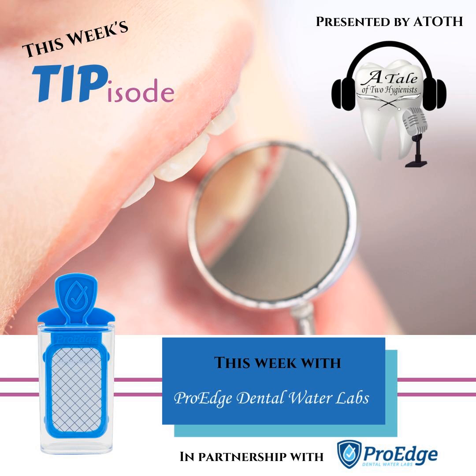It's more economical. And when you buy it, it's occasionally on sale. You can get it down to around $10. Let's say it's $10 per test. You put 4 samples from 4 devices in Op1, for example, so you do a pooled sample. That's $2.50 per test. People are paying way more than that to test their autoclave every week. So you're right, there you go.